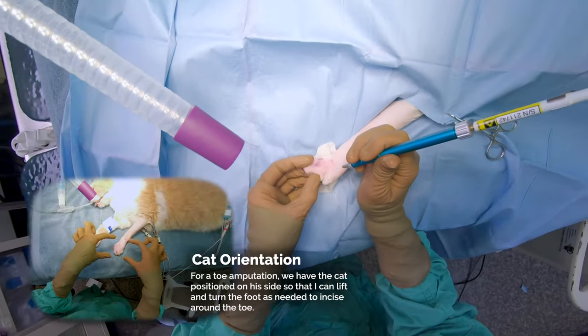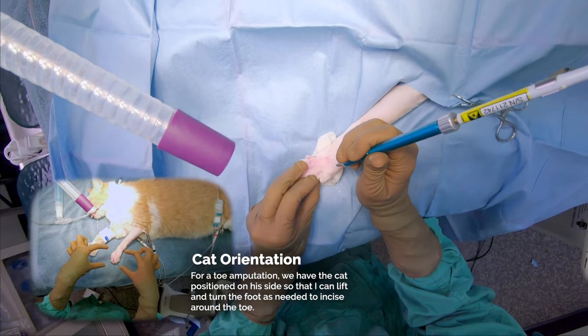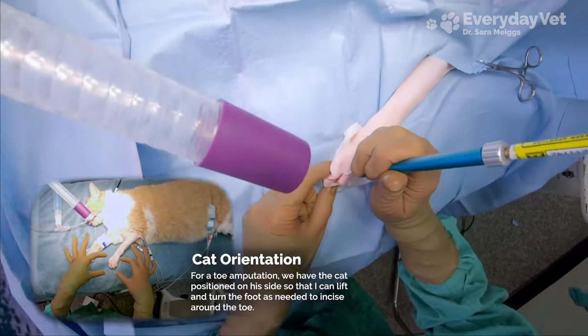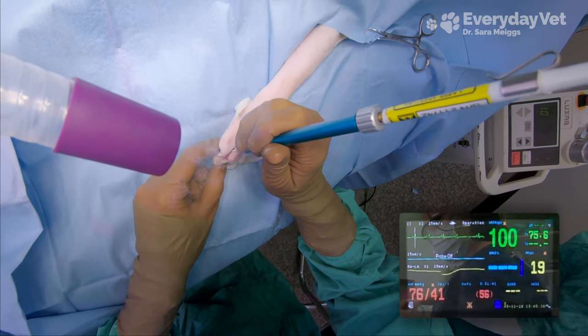We're doing a toe amputation on an obese 10-year-old cat because he has a tumor on the middle toe of his left front foot. He's laying on his right side with his head to my left and his butt to my right. Since he's obese, he is at a higher risk of suppression of his heart system, so we'll want to keep a close eye on the blood pressure.